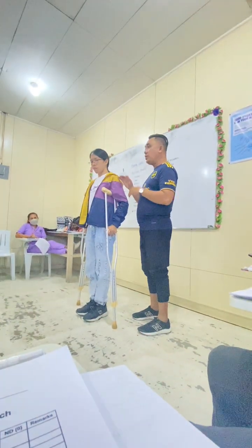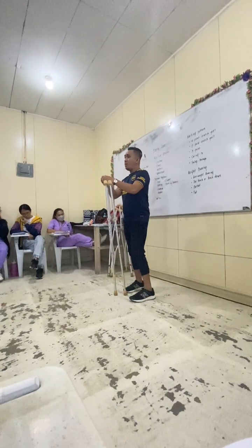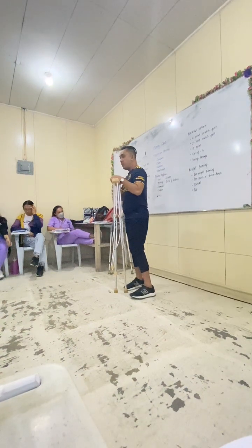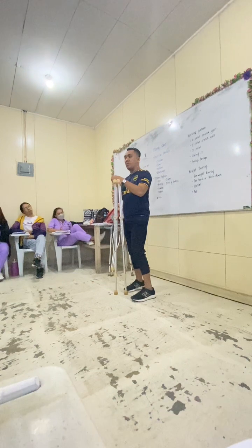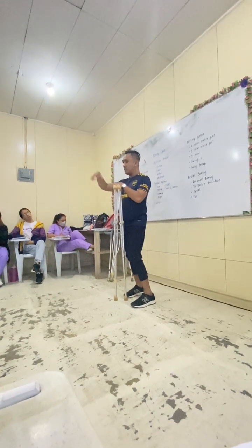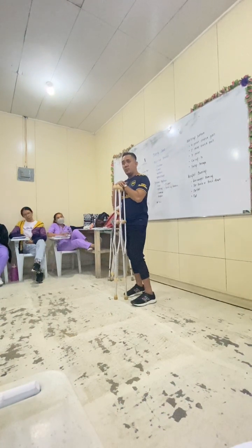You use it for patient who has weak legs. Okay? Although they can walk na siya, but the problem is that your patient can no longer walk straight because it's already weak na siya.